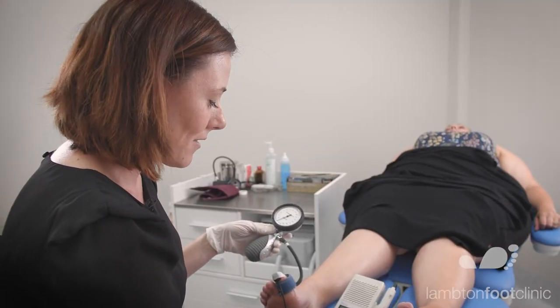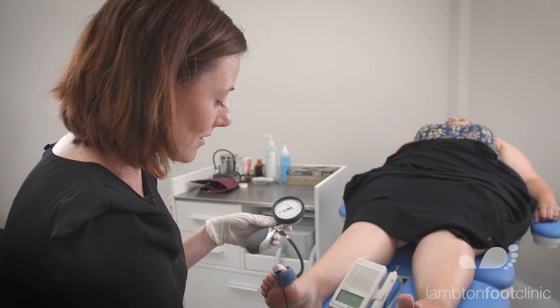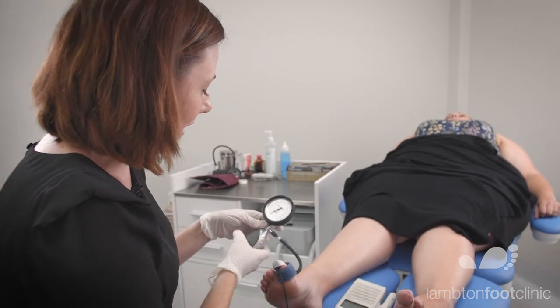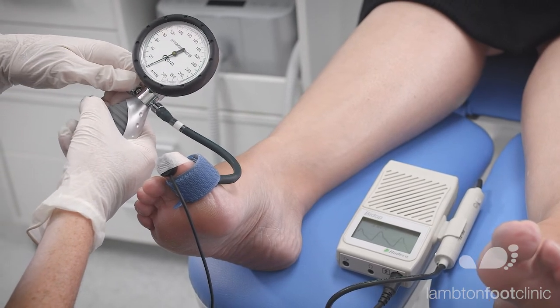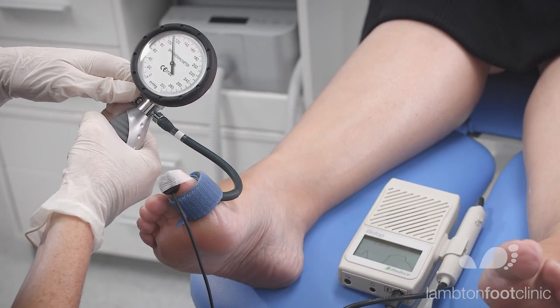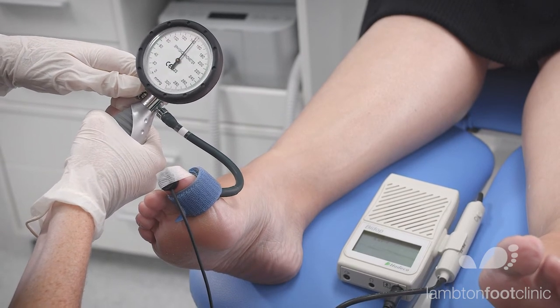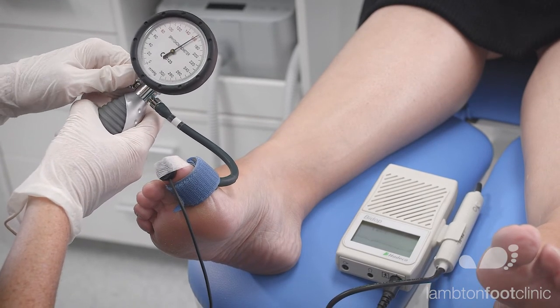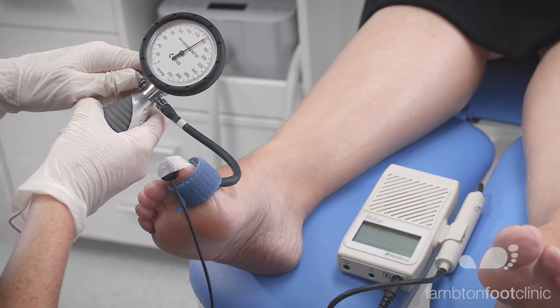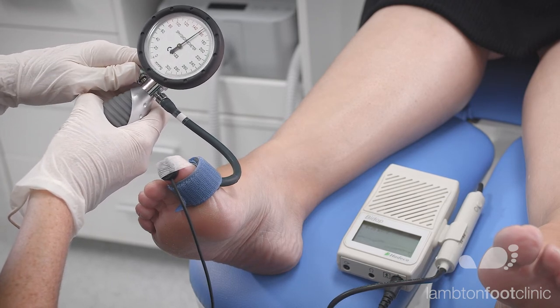So once we're happy with our PPG signal, so you can see that we've got a nice big waveform, which is great, we'll inflate the toe cuff until that signal becomes a flat line and about 20 millimeters more. And then we will just slowly release at about 1 millimeter of mercury per second, ideally.